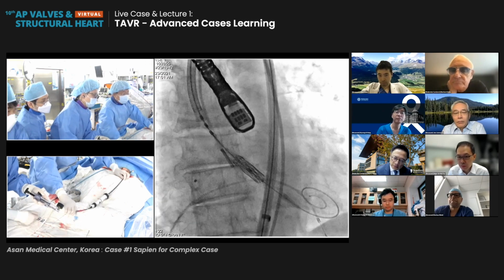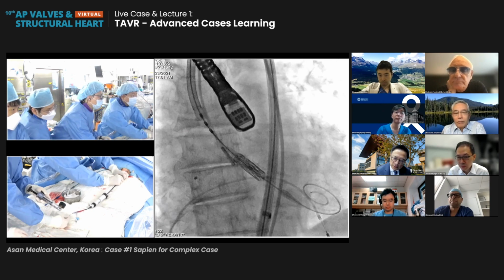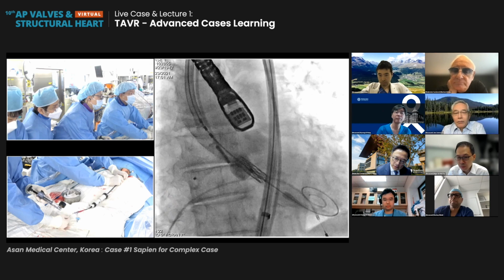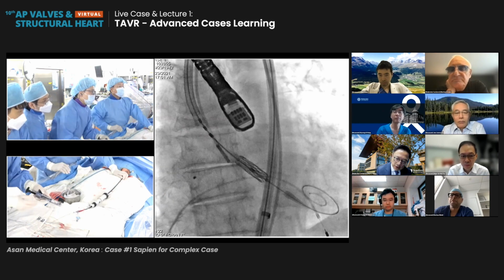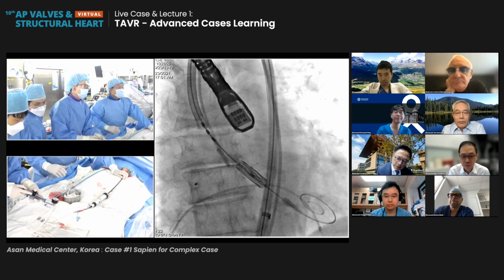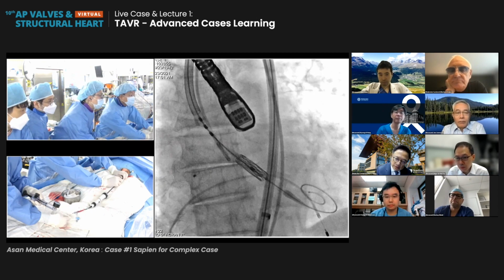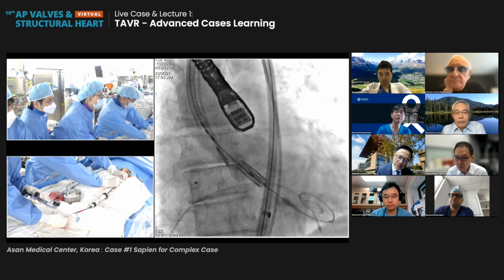Okay. LV wire, kept LV wires. I'd like to push in a little bit further. Test. Other thing. It's good. It's okay. Maybe a little deep. So careful. Yeah. Test. It's good.